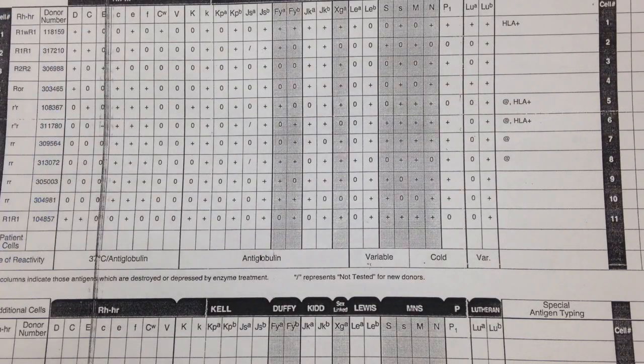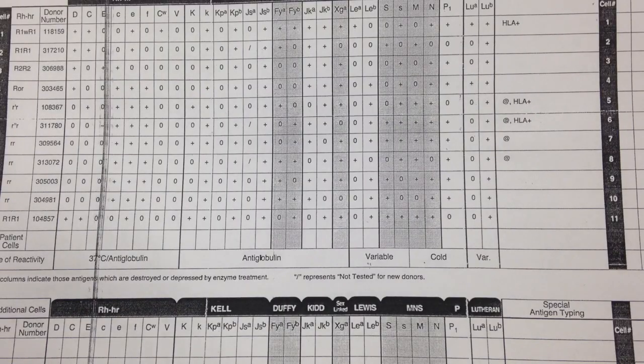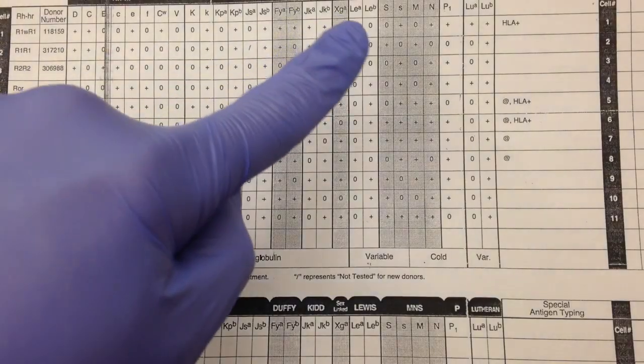Basically, the gel and the tube are done exactly like the screens are, which I already have videos for. But essentially, an antibody panel uses red blood cells with known antigens to identify unknown antibodies in patients. As you can see, the antigens are listed at the top, and all the pluses and zeros are basically what antigens are present on the red blood cells and which ones aren't. So in this, we're going to be testing patient plasma.